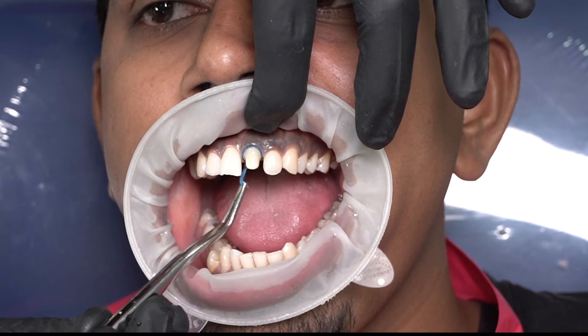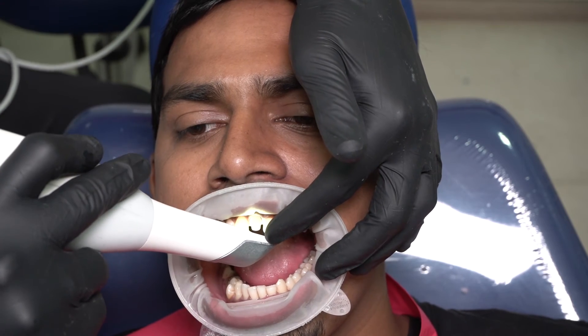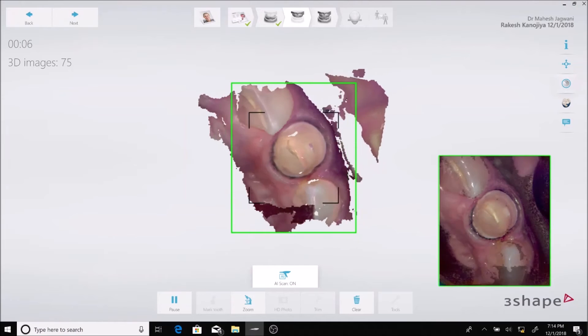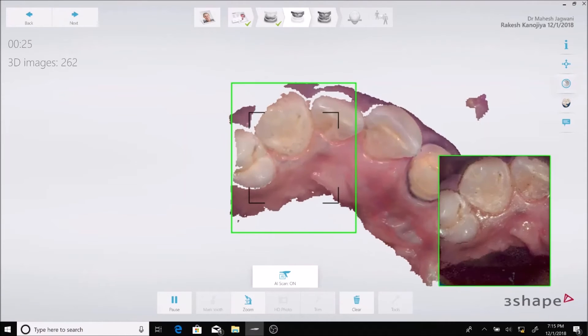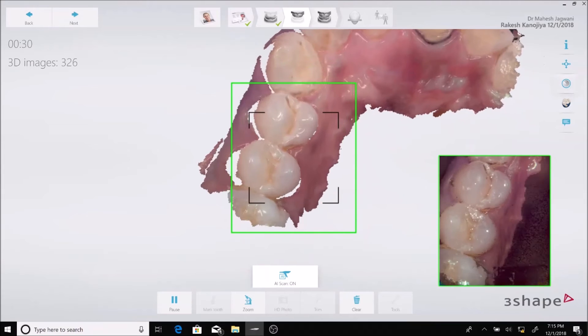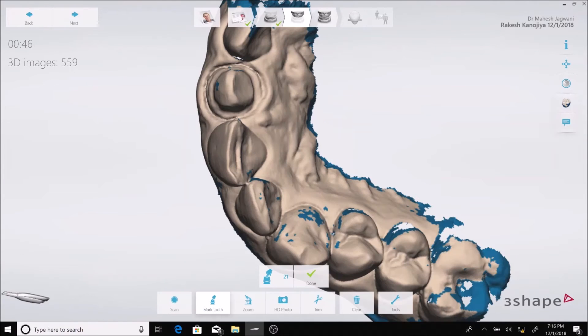The next step is to scan the upper arch with the preparation, and I have to remove the top cord — you can see that it has given me some amount of horizontal retraction as well. I scan the tooth from all angles and continue to scan the adjacent teeth, which will help me to occlude the scans in the next step. You can appreciate the clean marginal details on the file which the scanner has given me, and the technician cannot really mess it up here — that is the beauty of using an intraoral scanner.